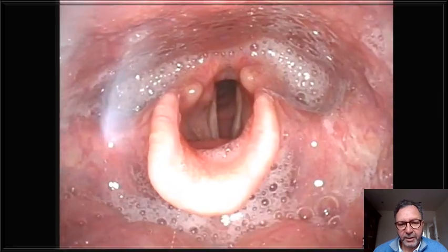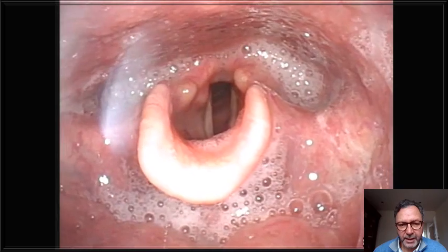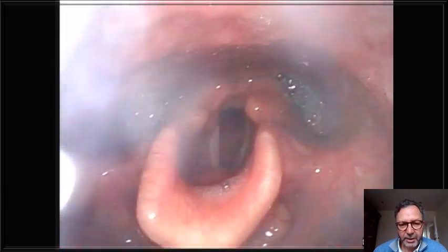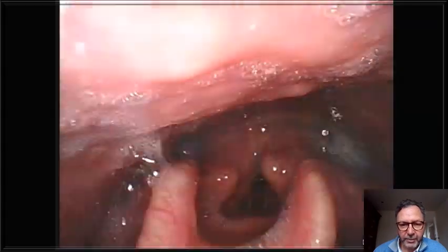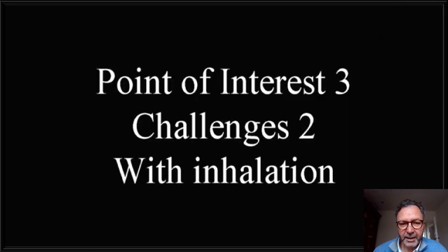And then you're gonna combine challenge 2 and 3. You see that the 4 quadrants are involved in this residue. The patient is swallowing now, and the saliva will be replaced by the blue, but the blue will never ever be cleared completely, and you will never have a clear pharynx, which is really key.